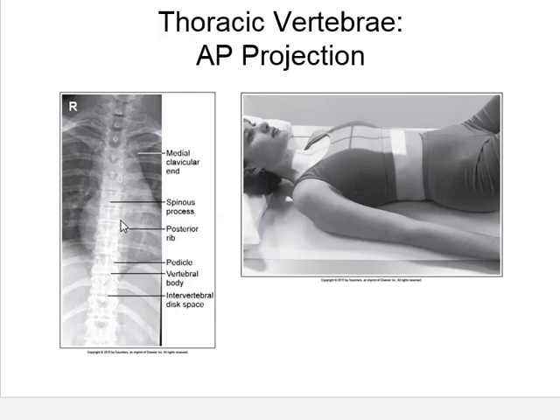Evaluation is very similar to a chest x-ray, only you're not really going to be able to evaluate the ribs unless, again, your hospital protocol calls for you to use an uncollimated view of the T-spine. That's probably going to be a little bit more rare, except for in trauma situations. In trauma, a chest x-ray is your AP of the T-spine. In most routines, they're going to want you to collimate for a T-spine.